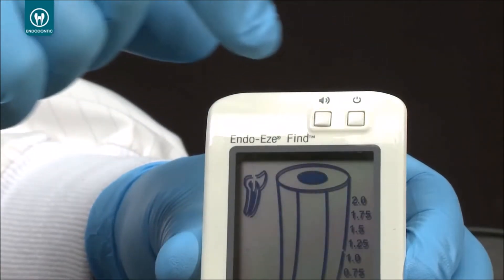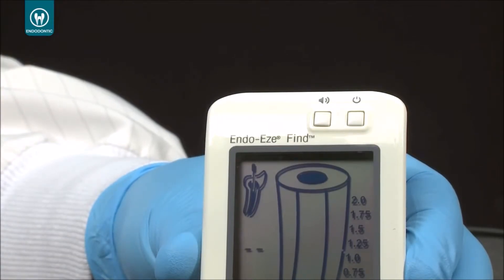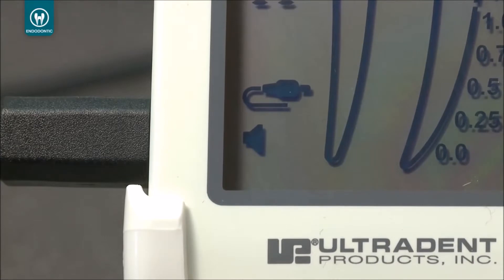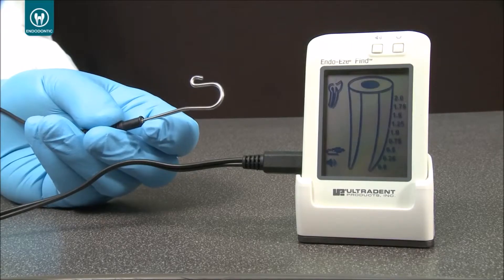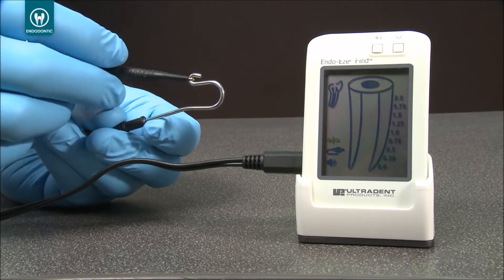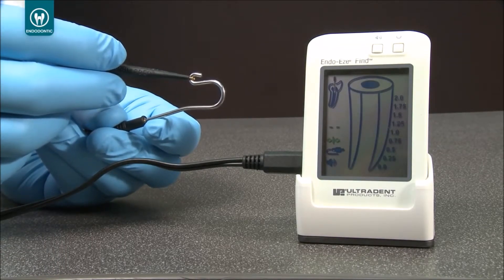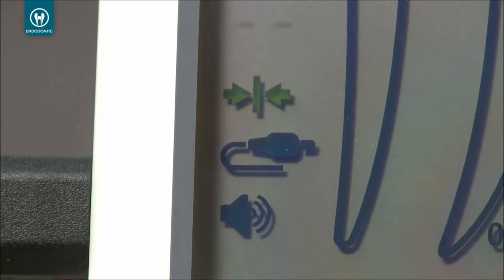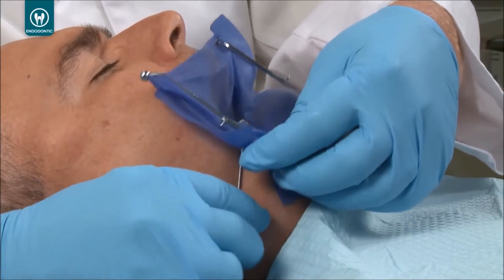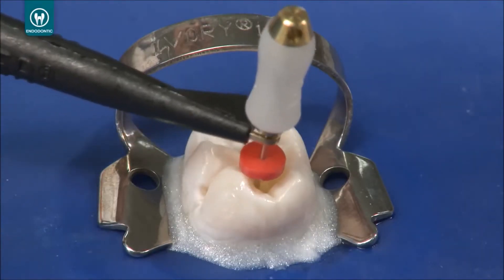Now get ready to perform the electronic measurement by turning the apex locator on. Plug the measurement cable into the left side of the device and make sure that the cable icon appears on the bottom left corner of the display. Plug the file clip and the lip clip into the measuring cable. Then touch the metal portion of the file clip to the lip clip — the connection icon should appear, demonstrating the electronic circuit is operating properly. Place the lip clip into the patient's mouth and connect the file clip to the file.